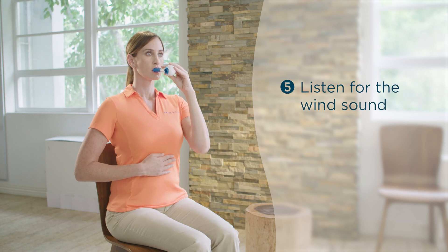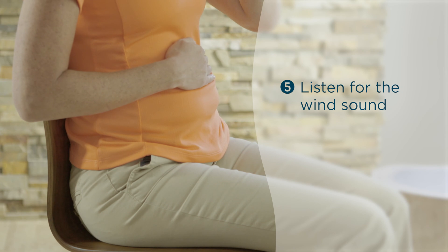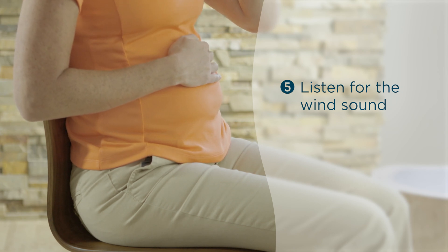Listen for the wind sound. You want to breathe in and out through the breather with enough effort and force to create an audible wind sound. If you're not hearing the wind, you're not using enough force. You may need to take a short break or lower the resistance on your breather.